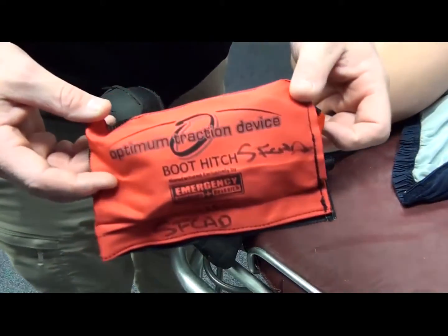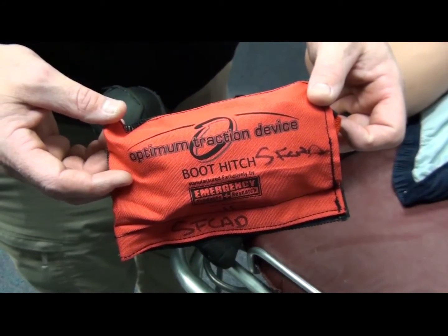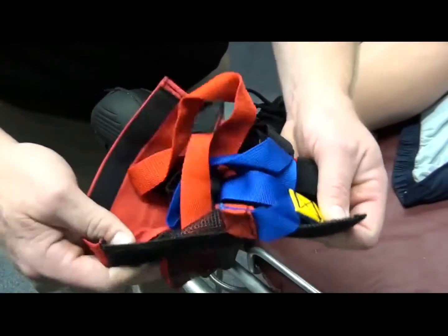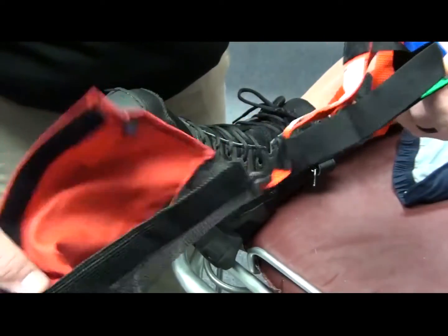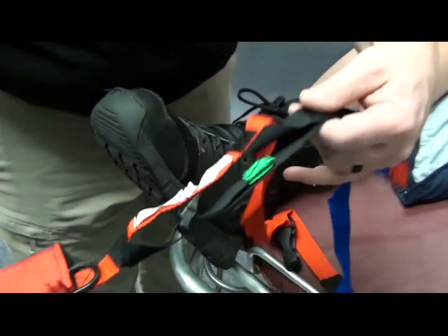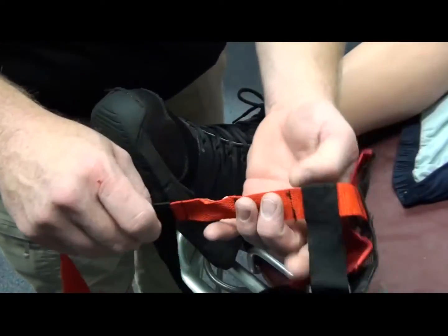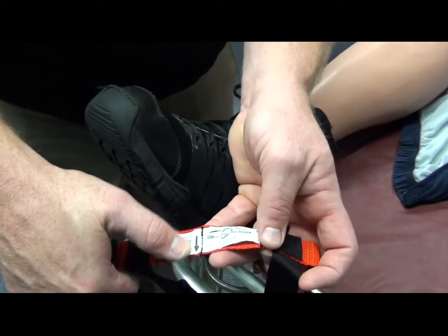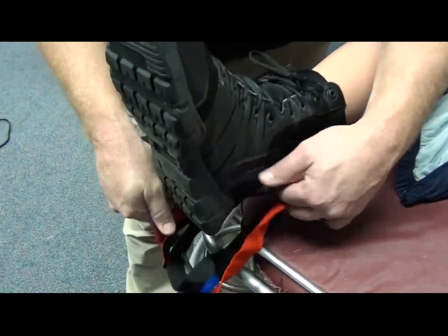Okay, so the boot strap, or the boot hitch. Okay, so simply open the package and let all the straps come out. The package actually stays attached to the straps. Alright, so move it out of your way. So the white strap actually goes against the ankle, the arrow pointing down is obviously not a real good indicator.